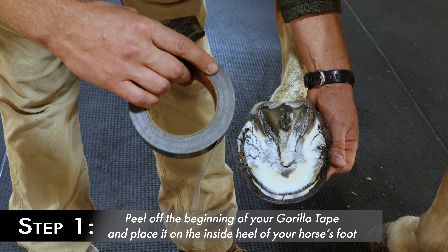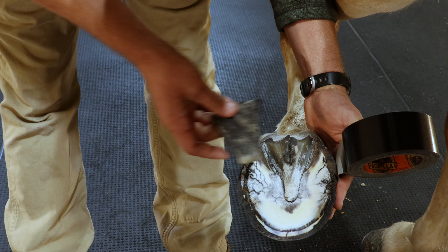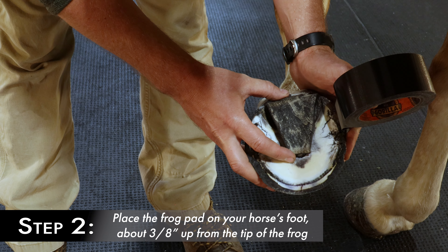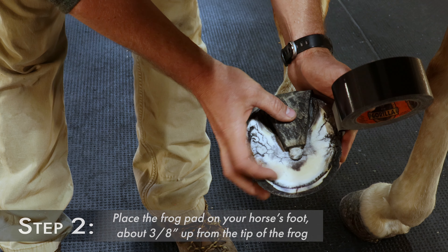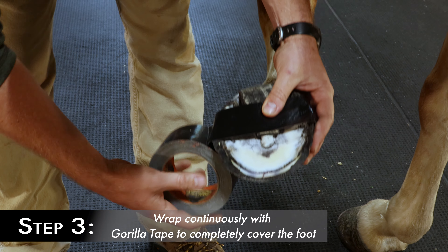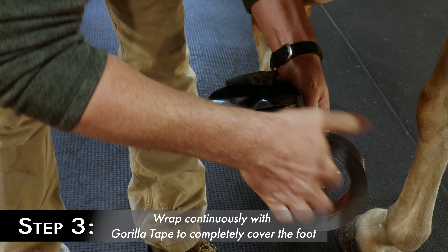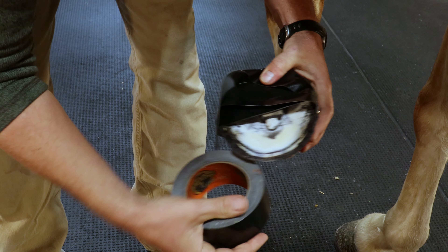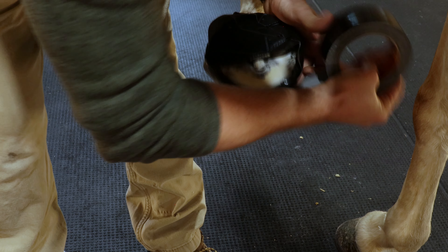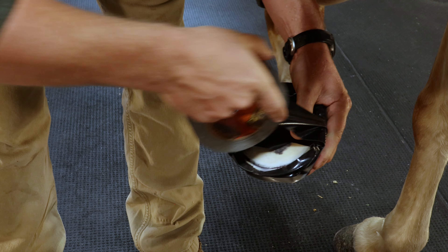Make sure you have the tag of the gorilla tape hanging off so you can just hook it on the foot. Place the frog pad over the frog — don't push it all the way out to the end. Put it back just about three-eighths of an inch, then wrap continuously with your duct tape until the foot is completely covered.